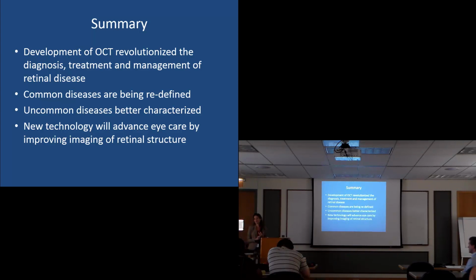I know the surgeons want to have the capability of using it in the OR. We want to have the capability of having handheld devices to give to the community so that they can screen themselves and come in when they have fluid, or just remote image their disease. Right now, if we follow macular degeneration, that patient who's probably 90 or older, can't see, has to get a driver, comes to the office every month to see if there's fluid. And if there's some way of giving that to that patient at home, that would be great.